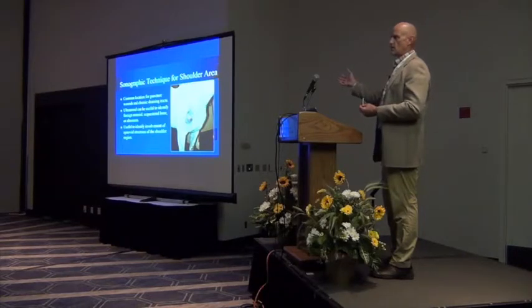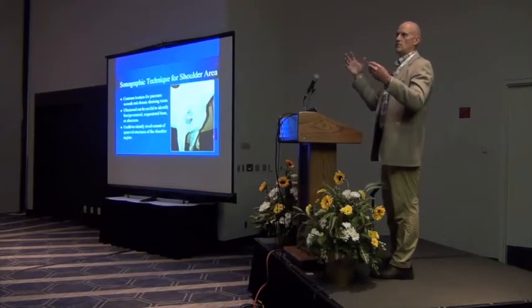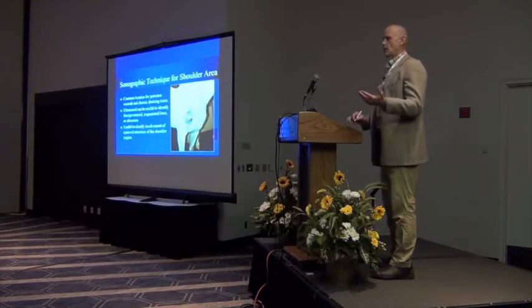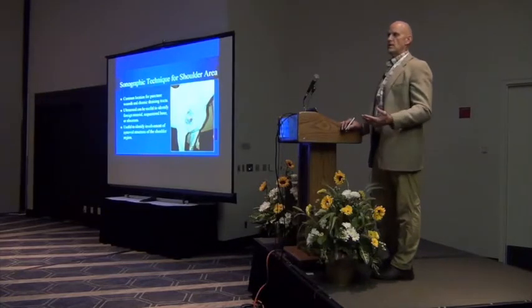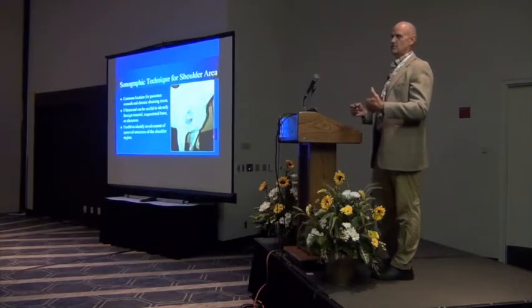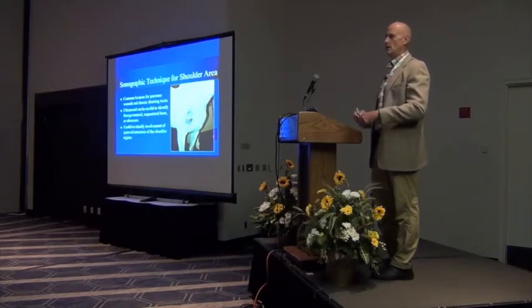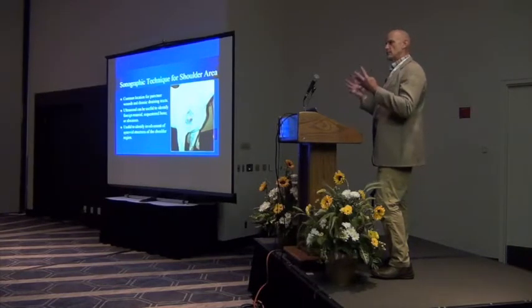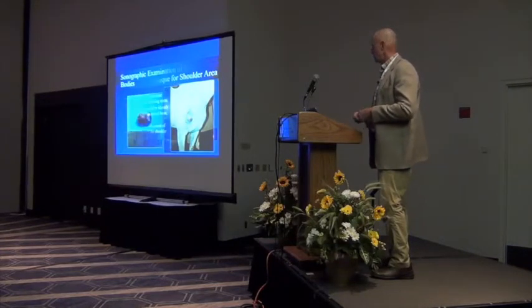If you're just trying to figure out with ultrasound what's going on, you don't have to use contrast material. You can even use just fluid and see if you can blow things up. And I think that's even true when you look at some of the other synovial structures in the joint. We do a lot of digital flexor tendon sheath blocks, right? And then we never look at them again. Well, you've just created a perfect environment to look at what's going on in the superficial flexor and deep flexor tendon in the sheath. You filled them with fluid. Don't forget to go back and scan them when you get done, because a lot of what we see in the sheath are peripheral tears, and the peripheral tears are these fronds of tissue floating out in the fluid. So use that to your advantage.